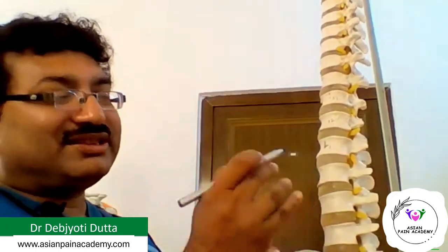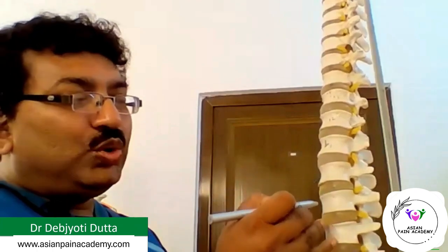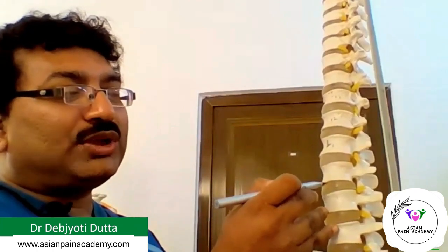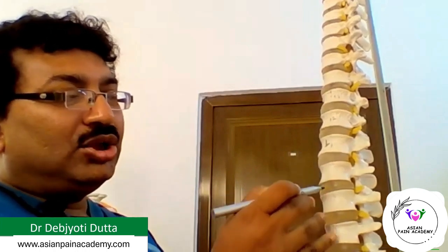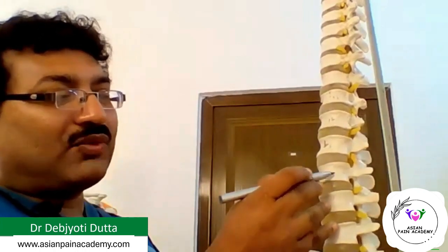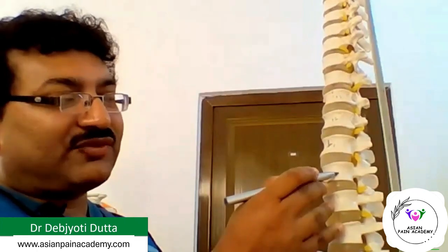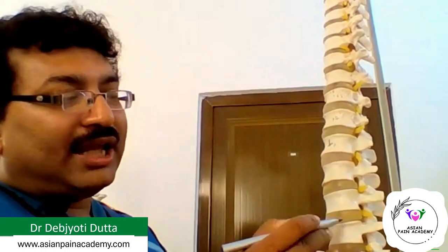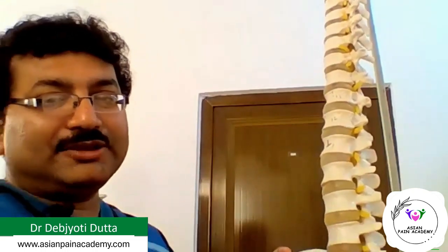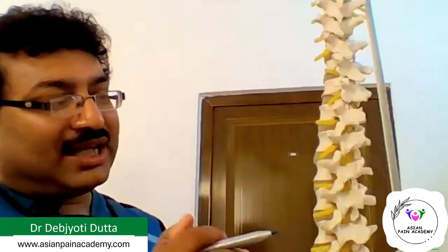Remember, L2 and L3 are closer to the L2-3 disc: upper 2/3, lower 1/3 in case of L2, upper 1/3, lower 2/3 in case of L3, and at L4 it is almost at the middle. So in between the vertebrae we have the disc, and we have to come from the posterior side.